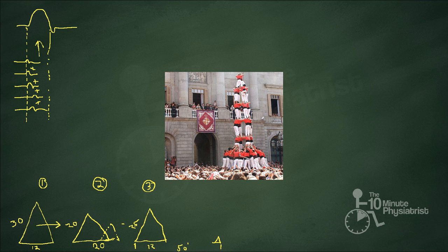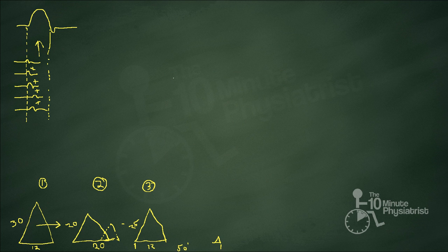So how does it relate to nerve conduction studies? It's probably become apparent to you if I redraw my population of fibers here, and I'm trying to draw them much the same as I did to the left side of the screen. They're all slightly different. And then suddenly we get to the fibers that were on the top of the pyramid, and they're a little bit slower. Not so much to be entirely separated, but enough to start to set up their own pyramid just to the right of our existing pyramid.